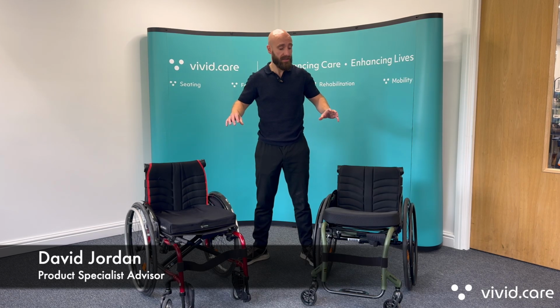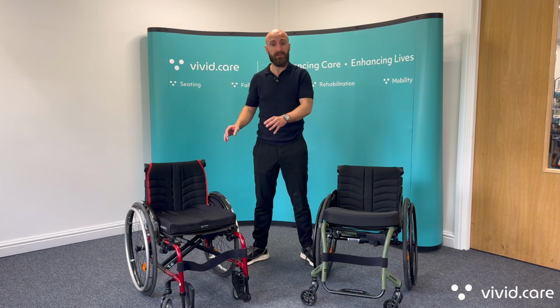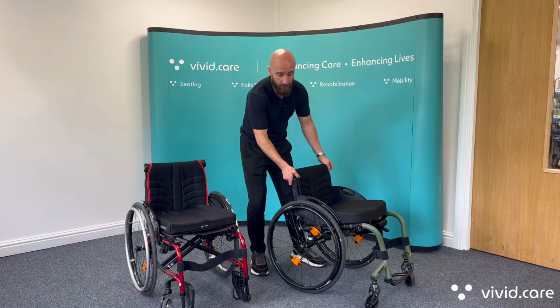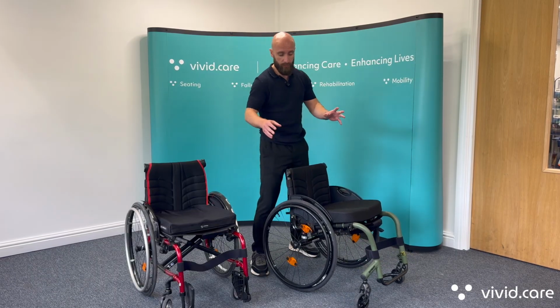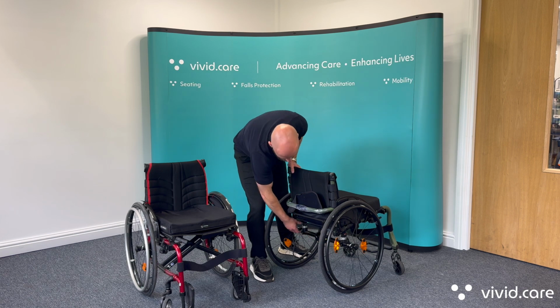I'm here to explain today about the differences between rigid active user wheelchairs and folding active user wheelchairs, just to try and help understand the differences between them. So this, as a rigid wheelchair, is one of our popular models. It's called the Quickie Nitrum, and basically what rigid means is that it doesn't fold like a traditional wheelchair in the middle, so you've got a rigid bar across there.